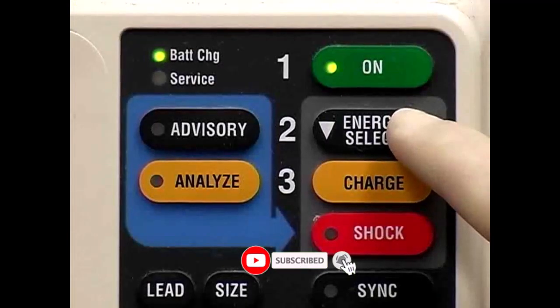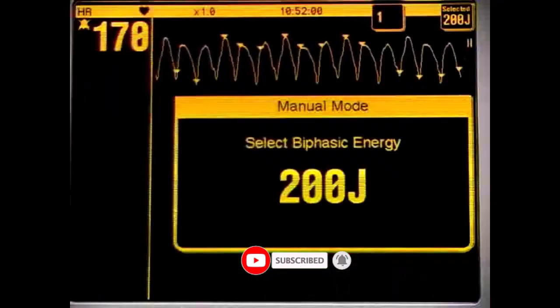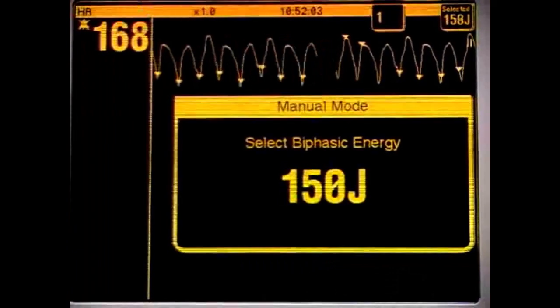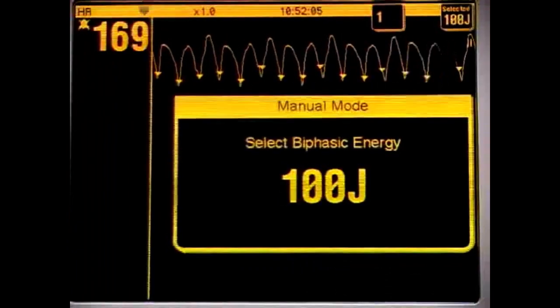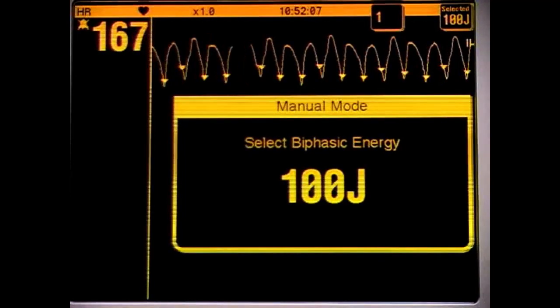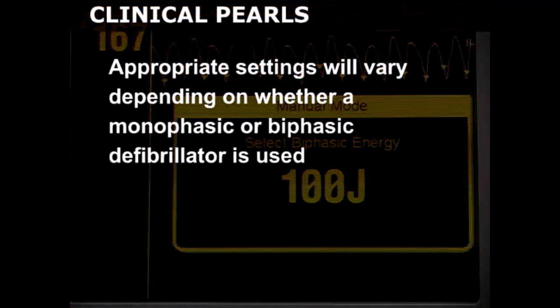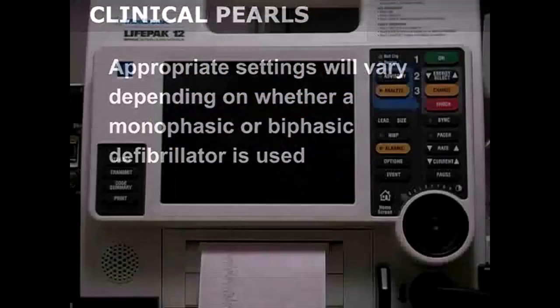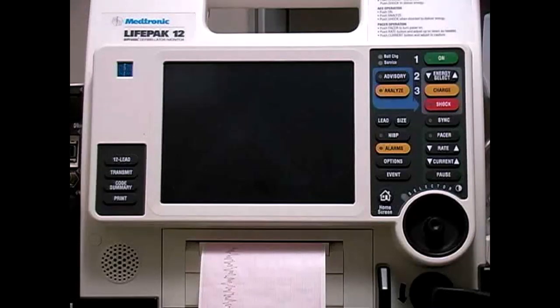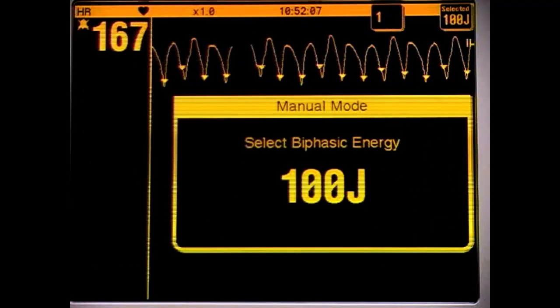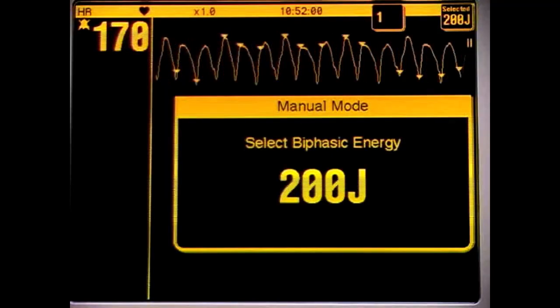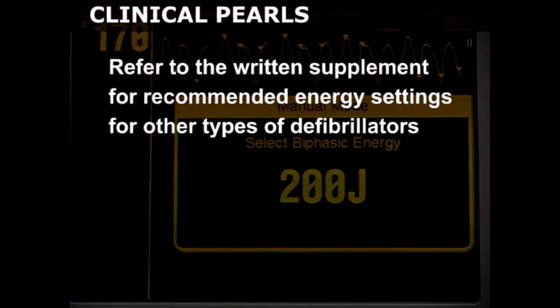Next, push the Energy Select button on the monitor to choose the appropriate output for the first countershock. The energy selected will be displayed on the monitor screen. Appropriate settings will vary depending on whether a monophasic or biphasic defibrillator is used. For the device depicted in this video, which incorporates a biphasic rectilinear waveform, 100 joules is used for the initial shock and all subsequent countershocks are 200 joules. Refer to the written portion of this chapter for recommended energy settings for other types of defibrillators.